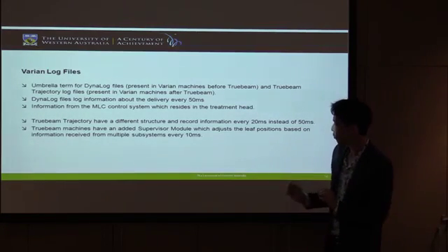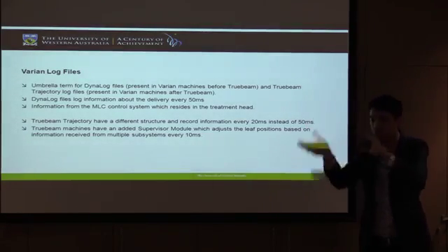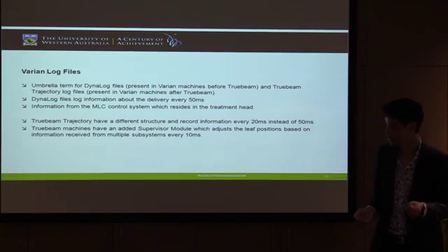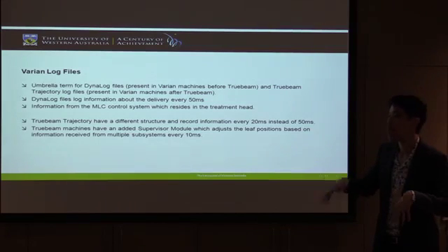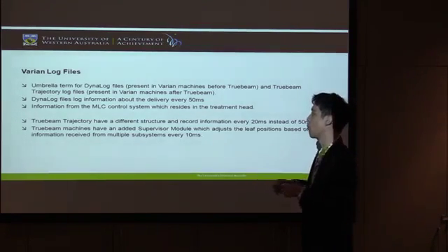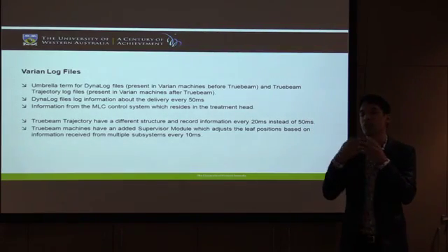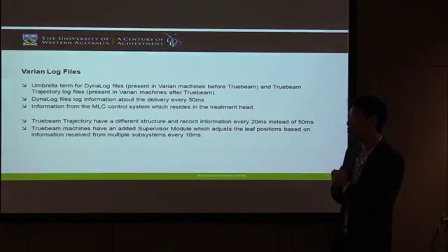So the MLC system resides in the treatment head, which rotates around the patient, and it's pulling all this information in. The TrueBeam trajectory log files have a different structure from the Dynalog files. I'll go into the structure in a second. And instead of recording information every 50 milliseconds, it records information every 20 milliseconds. So you've got a higher resolution there.